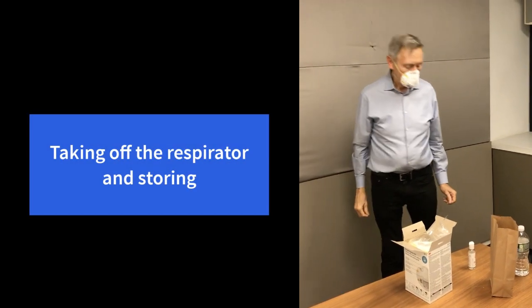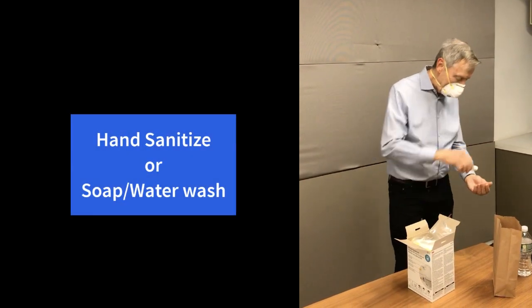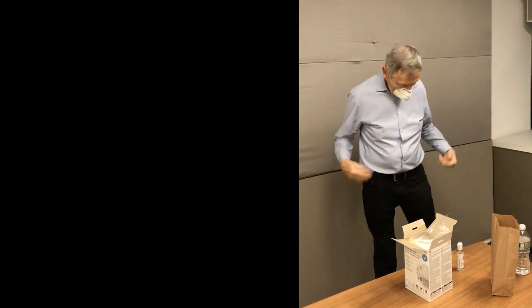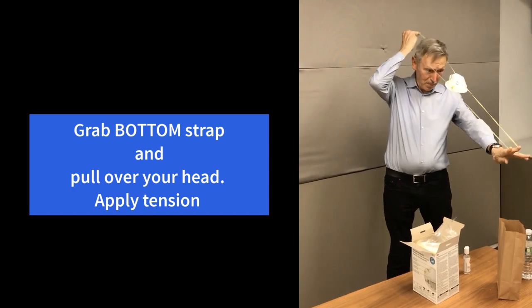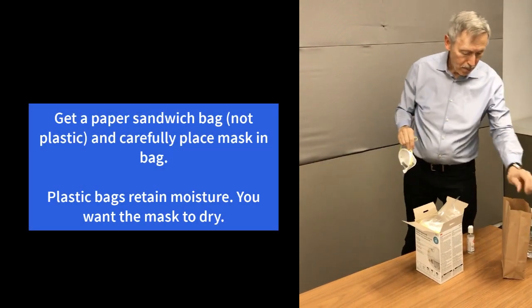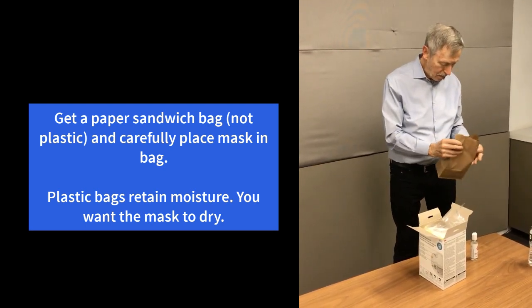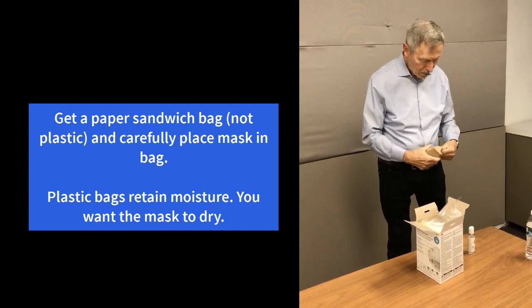Now, what about taking off the respirator? Of course, hand sanitize because the outside of the respirator and parts of your body may have contamination. He's going to proceed to grab the bottom strap, pull it far away, and then the top strap. Notice he did not touch the outside of the mask. He's going to get a paper bag — a typical sandwich paper bag — drop the respirator in, close it, push out the air, and then squeeze it so that there's a tight seal on the inside.